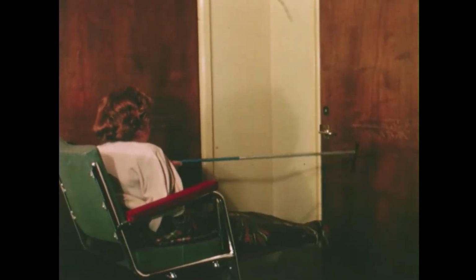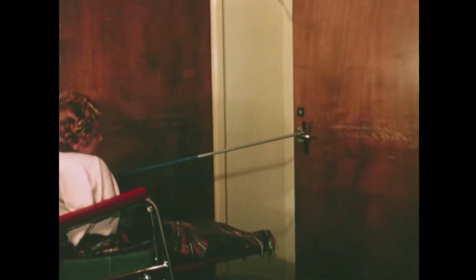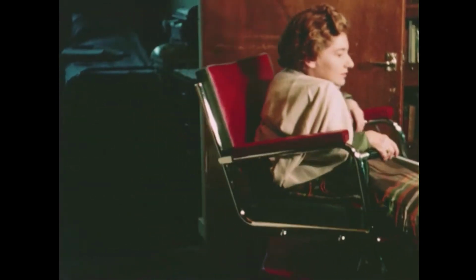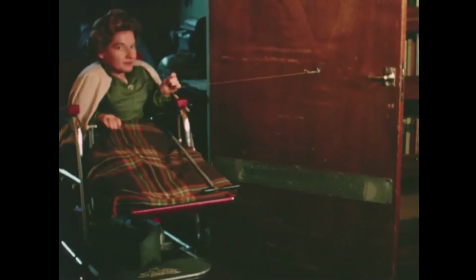Next, a woman in a motorized wheelchair approaches another door. Tony's door-opening gadget saves her a lot of time waiting for other people to do it for her. Tony uses a long stick with a bar at the end to turn the door handle and open the door. A long string dangles from the back of the door. It has a slim bar of wood at the end for gripping. The door closing device is even simpler. Once out of the room, Tony pulls the string towards her, which pulls the door shut again.